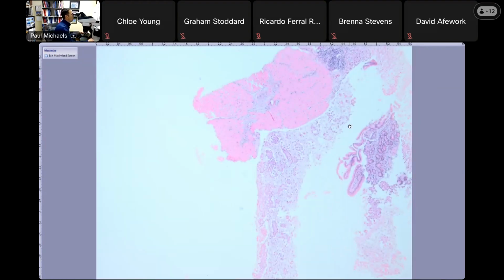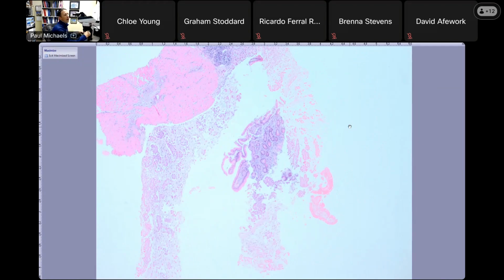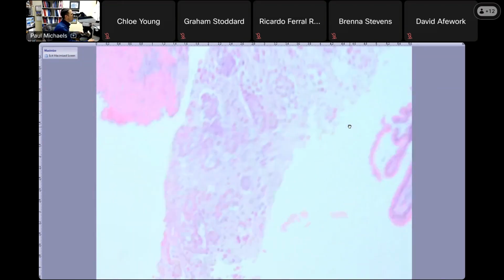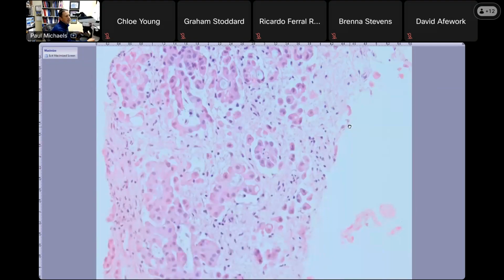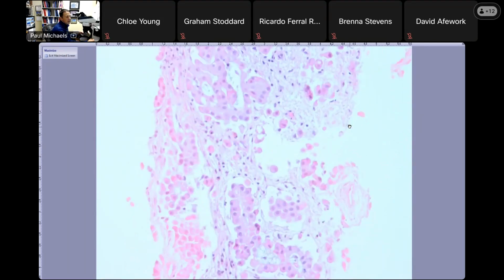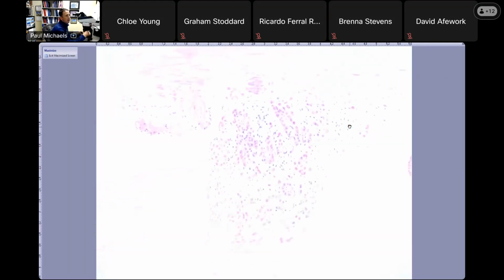And then one more thing to keep in mind, this is a small intestinal biopsy. It was a core biopsy done of a small intestinal mass in a youngish woman. So when you have a young woman with a mass in her abdomen, you invariably are going to think about GYN tract stuff, serous borderline tumor, serous carcinoma, etc. And I think that could look like this, kind of a papillary appearance.